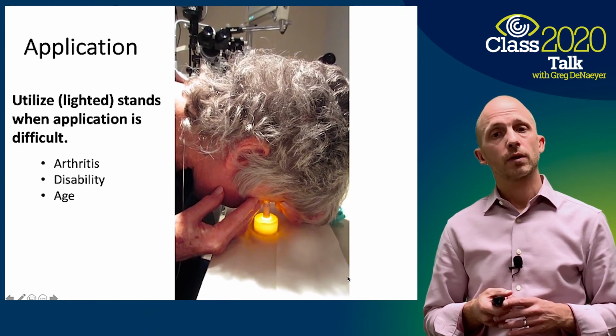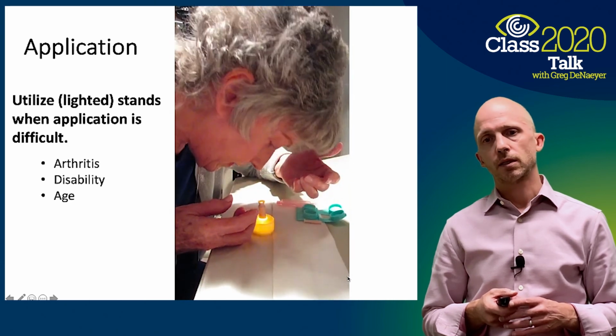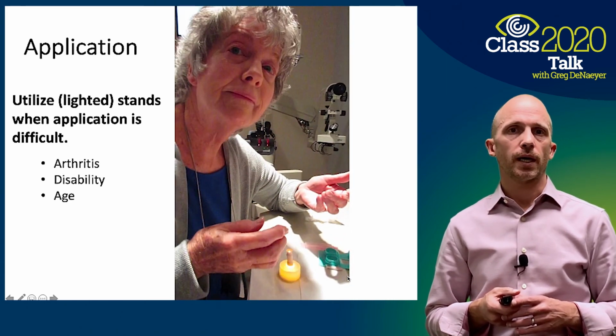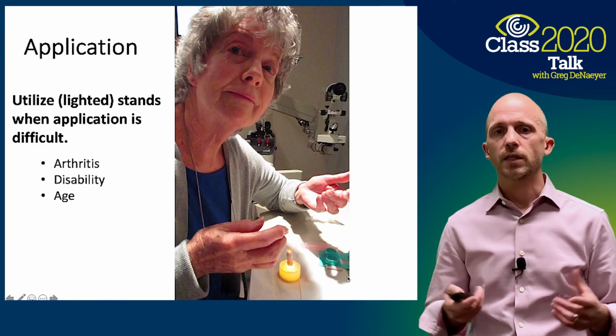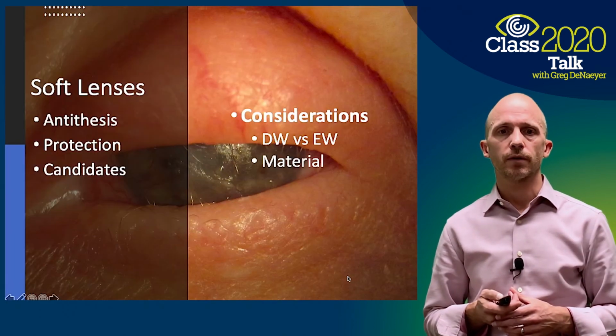Eventually let go of her lids, and then sit upright, and voila, she has the lens on. So very nice. And I will definitely say that I will prescribe and utilize a lighted stand for scleral lens application probably one time a week. And again, it can be the difference between success and failure.